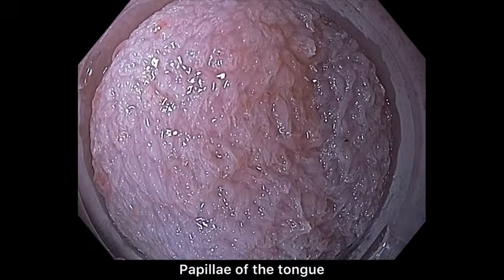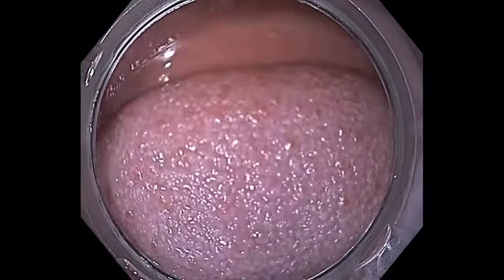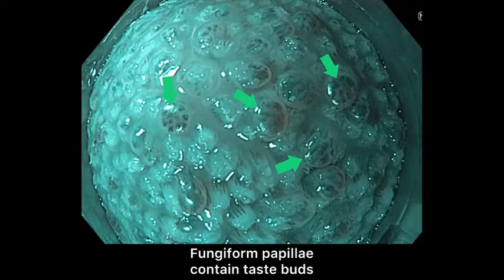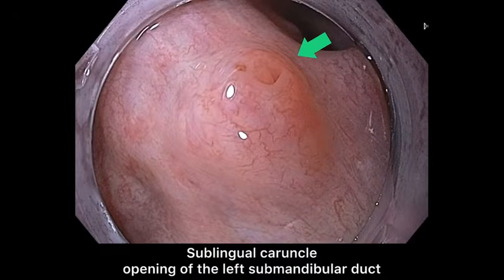Papillae of the tongue. Filiform papillae help with sensation of touch. Fungiform papillae contain taste buds. Sublingual caruncle and the opening of the left submandibular duct.